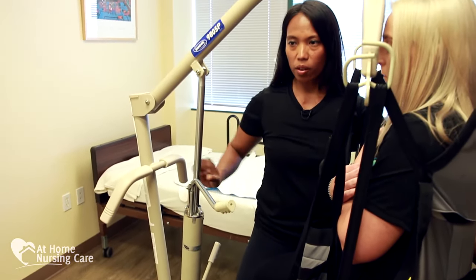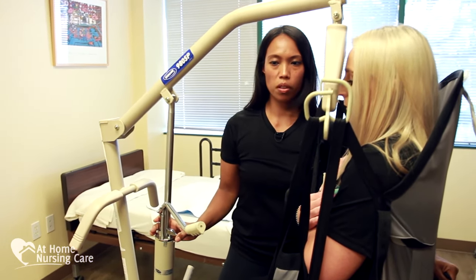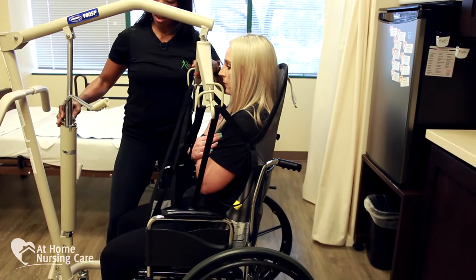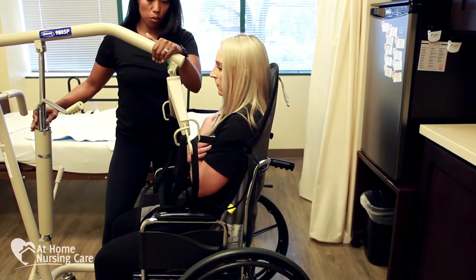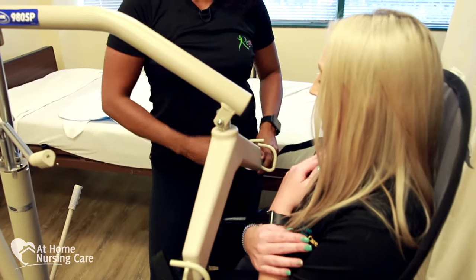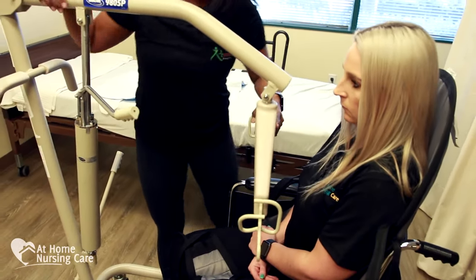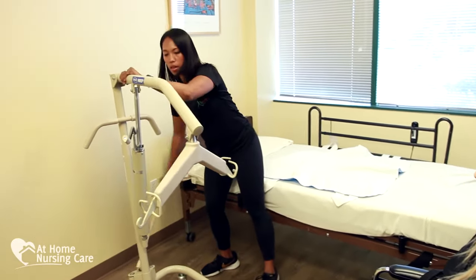The control valve turned counterclockwise will slowly lower her down. Arms are crossed over the chest, and as I'm pulling her back, I'm watching the swivel bar to make sure it doesn't hit her head. It goes all the way down. Once it comes down to where there's slack on the sling, I can take out the sling safely. Then unlock the Hoyer, wheel it out, and bring the base back to a narrow stance.